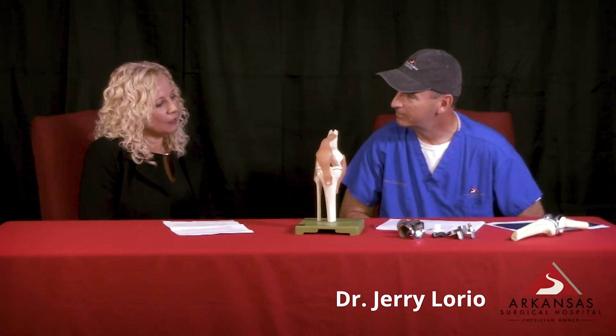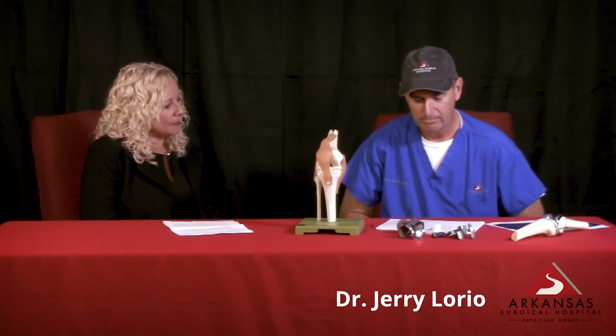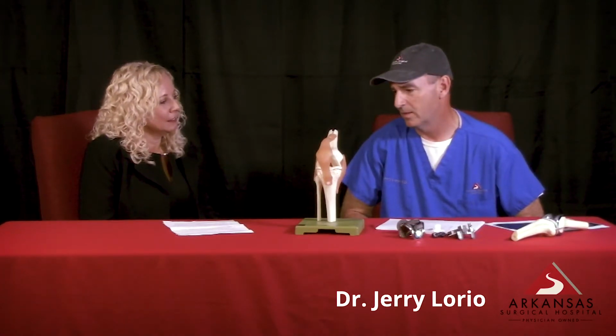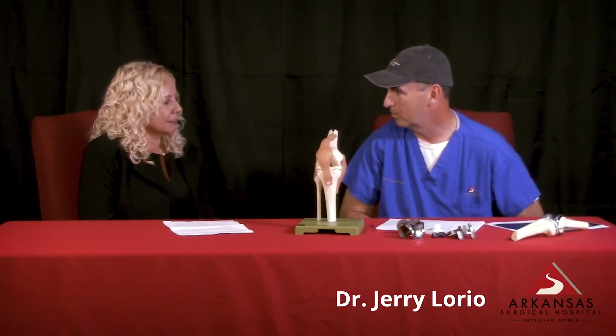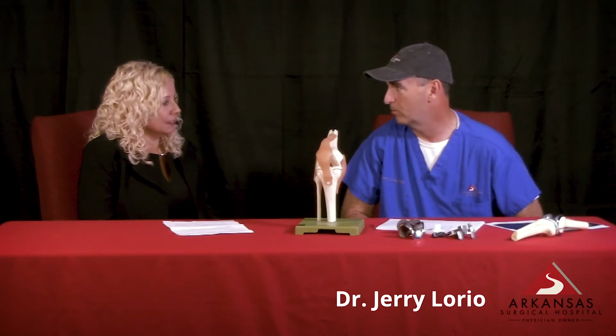So how long are the knee replacements lasting now? 20 years ago, we used to tell everybody 10 years, but now I'd say there's a 95% chance that it'll still be in your body in 20 years. And that's really good for any surgery.